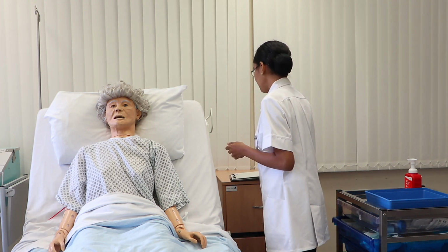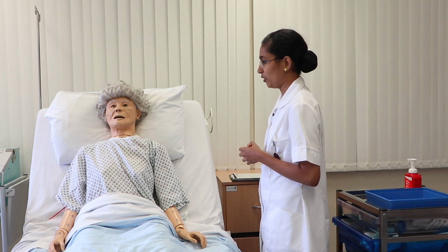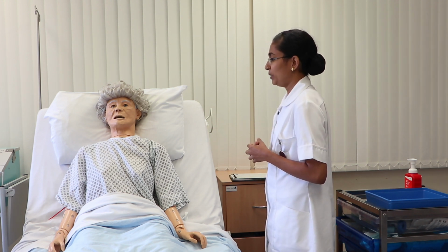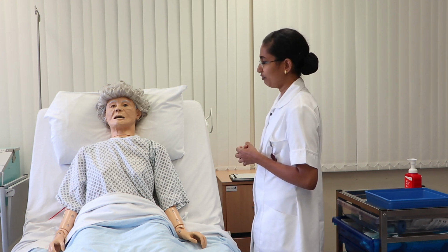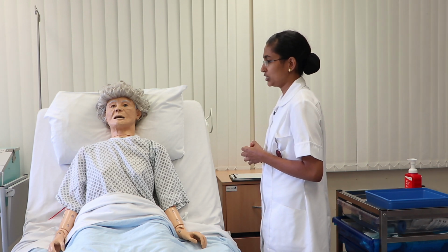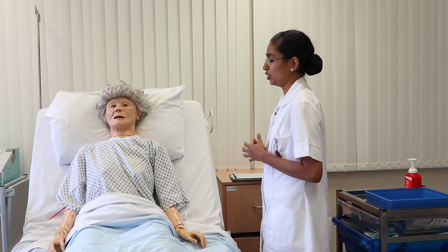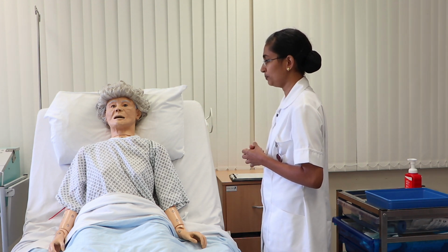Okay, Bob, the reason I am here is to administer you an inhaled medication, that is salbutamol. It is to ease your breathing and open your airway. As with any medication, it has side effects. You may feel dry mouth as well as palpitations, but don't worry, I will be here to monitor you for 30 to 60 minutes after the procedure. Is that all right for you?